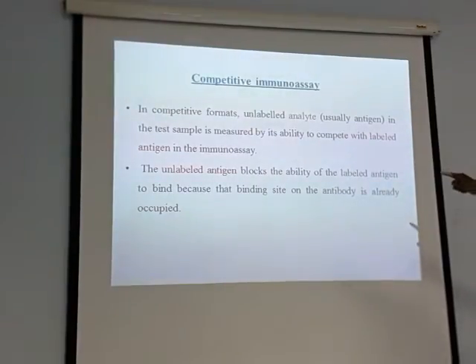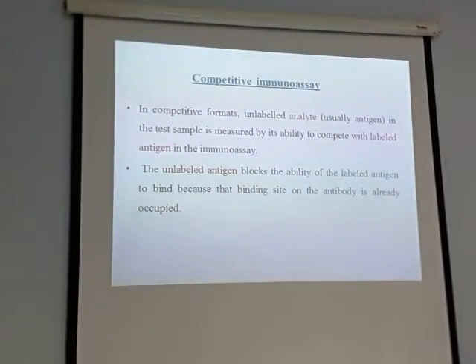So the unlabeled antigen blocks the ability of the labeled antigen. We have the antibody, we have the serum sample, and we have the labeled antigen.